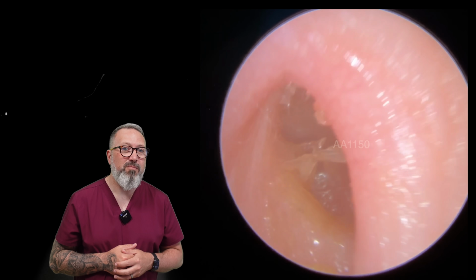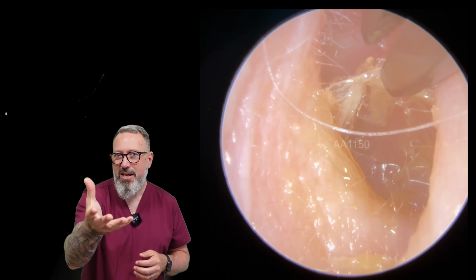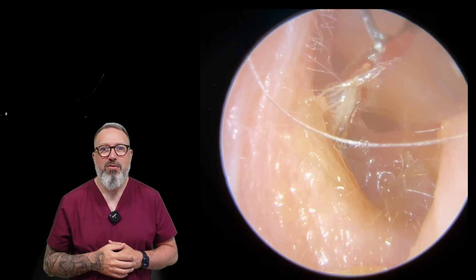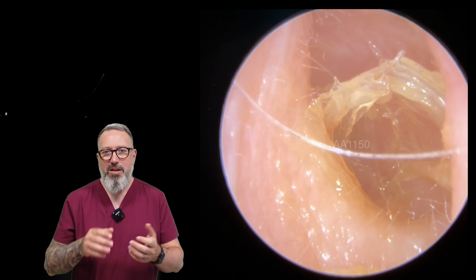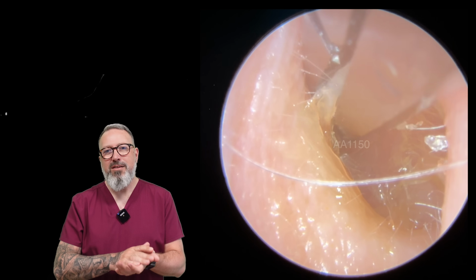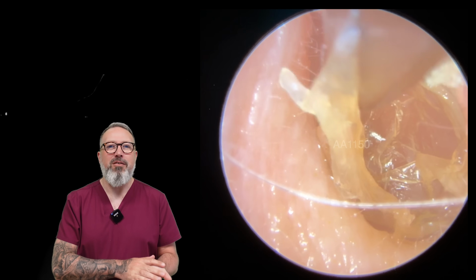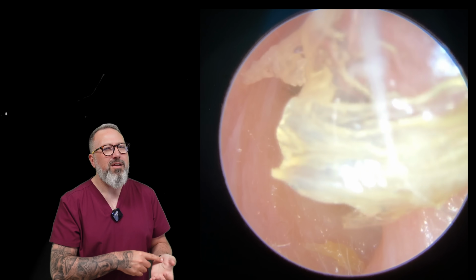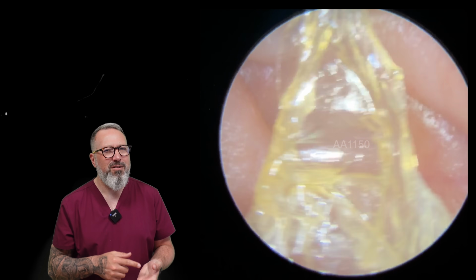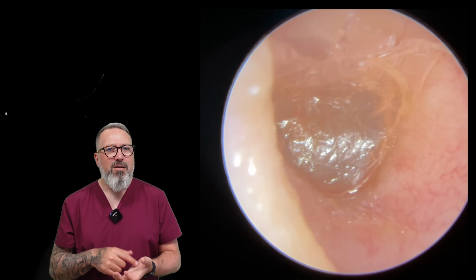Oh, it drew that back. So you saw that back section move just a little bit. Let's see what happens now with the forceps on this section. But look how all that is peeling away. It's a bit like, you know, we used to have, there's a name for it. Over here, it's kind of PVA glue, we call it. It's the stuff we use in school. I think in the US, you guys use Elmer's glue. I think that's the kind of stuff. But yeah, it comes away really well.